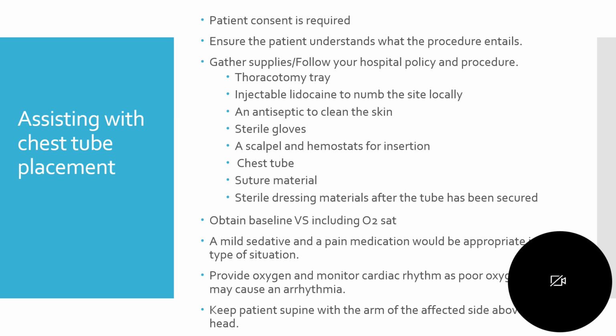Always follow your hospital's policy and procedure of how this procedure takes place. What are the steps? What are the supplies? Because there may be some slight differences between hospitals. But you're going to get a thoracotomy tray.